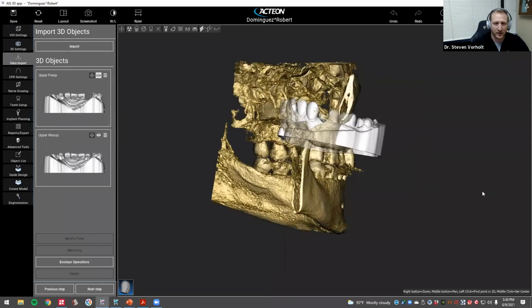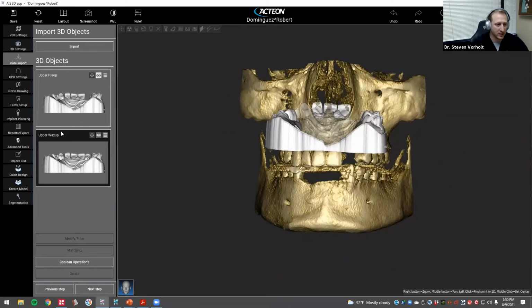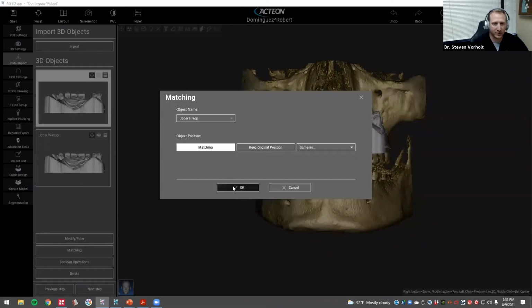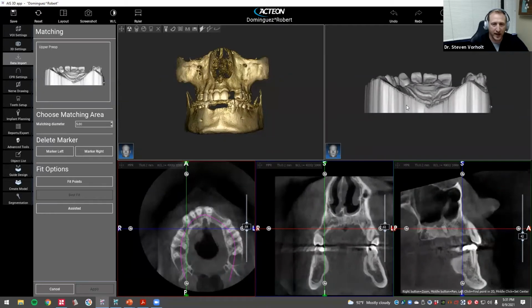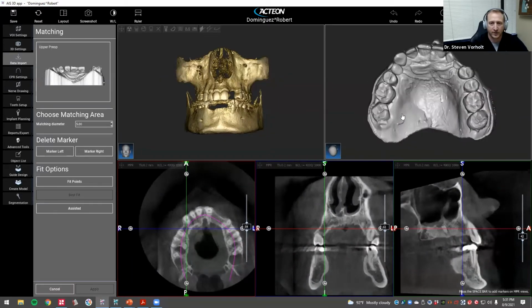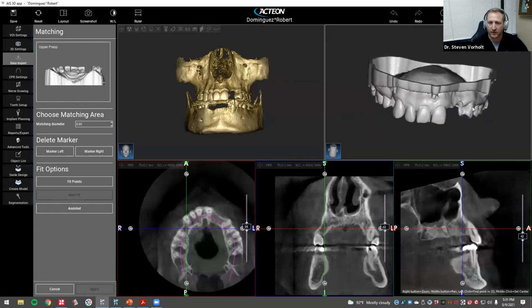So what I'm going to do is I'm going to stitch this together, because right now where this is imported is completely useless. It looks like the model is in the patient's nose. So I'm going to match, select this and hit match. And what's nice about Acteon is I can now look at, here's the model. So my digital tech Mark has made some ovate sites here. So for where I'm going to be placing the final restorations.